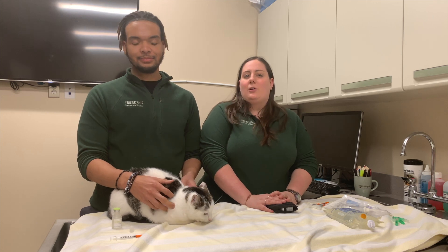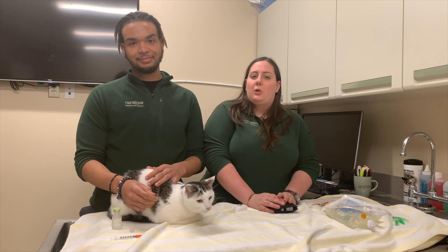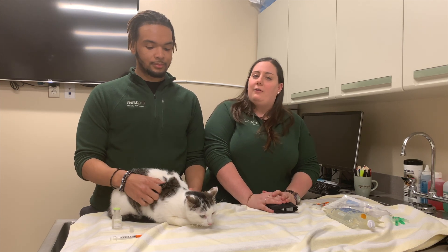Hi, I'm Miranda. This is Brandon. We work with the Internal Medicine Service here at Friendship Hospital for Animals. This is Butch, and today we're going to show you how to do a blood glucose curve at home and also how to give insulin.